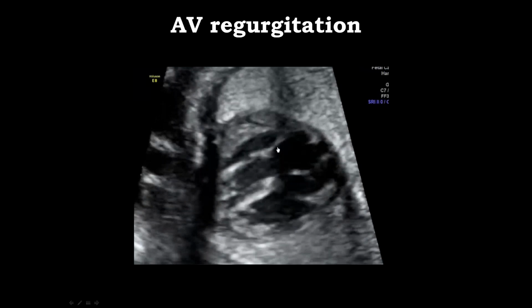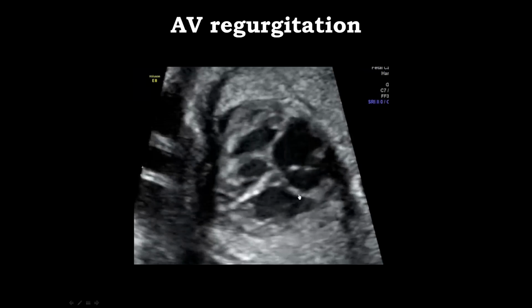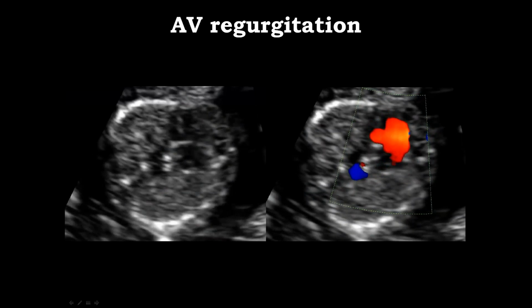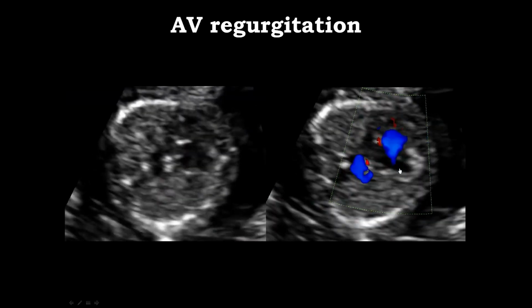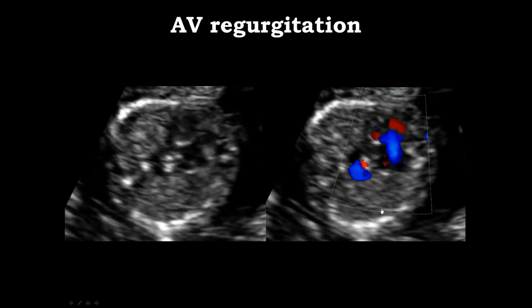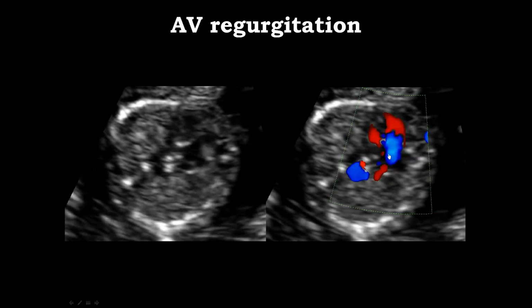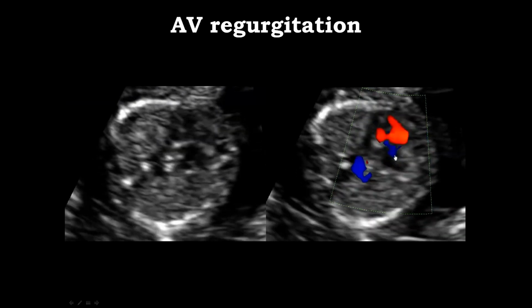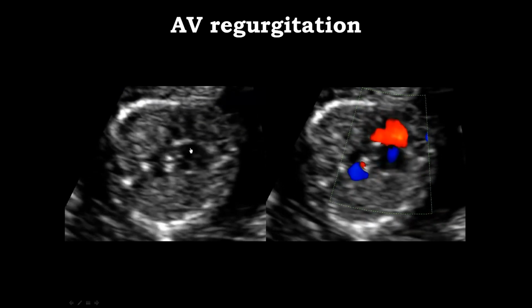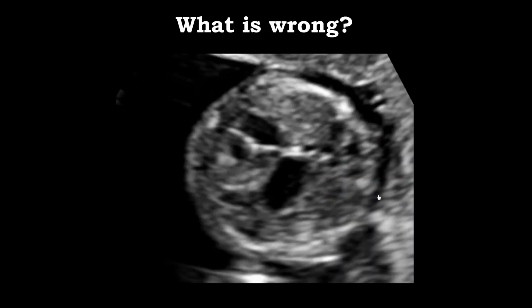And even more important is to see mitral regurgitation, because the presence of mitral regurgitation pretty much always is a marker of a major congenital heart anomaly. Sometimes you can see regurgitation not on the left side, not on the right side, but kind of in the middle of the AV valve area. And this is also a very important marker. If you see that right at the base of the heart, where the crux of the heart is, that means that most likely you are dealing with a common AV valve. And a common AV valve tends to leak right in the middle. So that also will be very helpful in your early detection of cardiac anomalies.